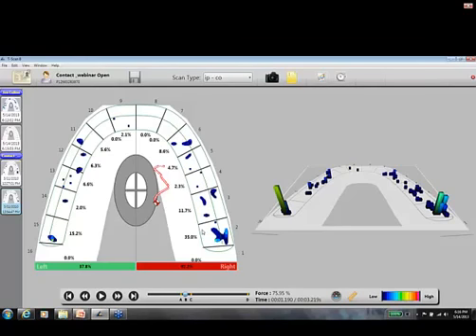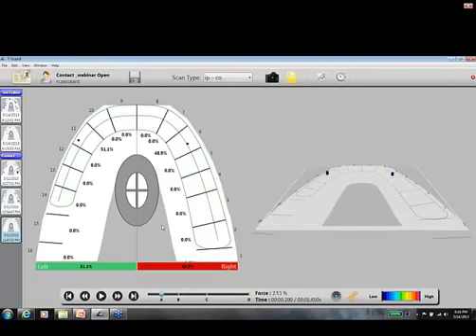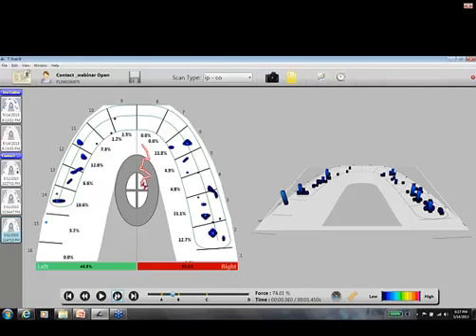We now go in with paper. We mark it up. We know we're going to number 2 and number 15. And let's see this, 1247 we'll go to. So this whole process was 20 minutes. Now the patient comes into their bite, and where we ended that day was here. So the patient's 55-45, 14% of force on number 2, 20% or 19% on number 3.